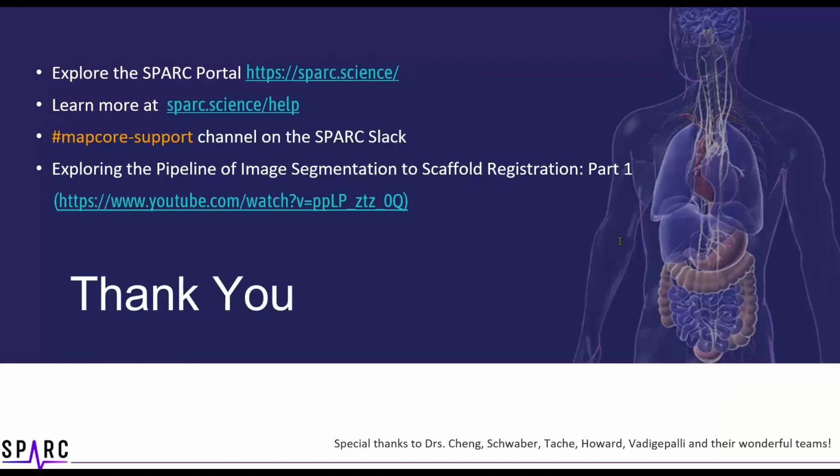There's another question. It says, it was not clear from the demonstration how tissue layers and compartments are represented in the scaffolds. Could you comment? At least for the colon scaffold, we haven't marked out the different tissue layers, but if we have information about the anatomical location, like the spacing between the tissue layers, or special landmarks that we can use, we can quite easily mark it out in our scaffolds.